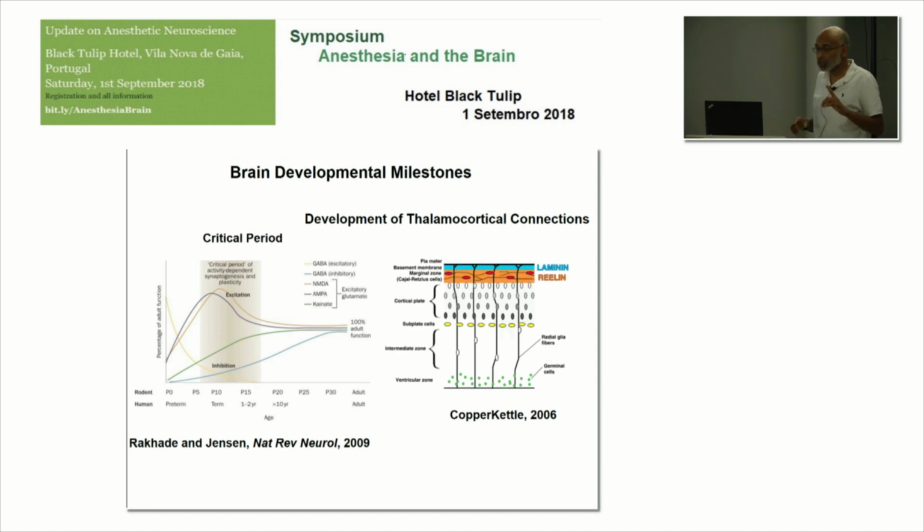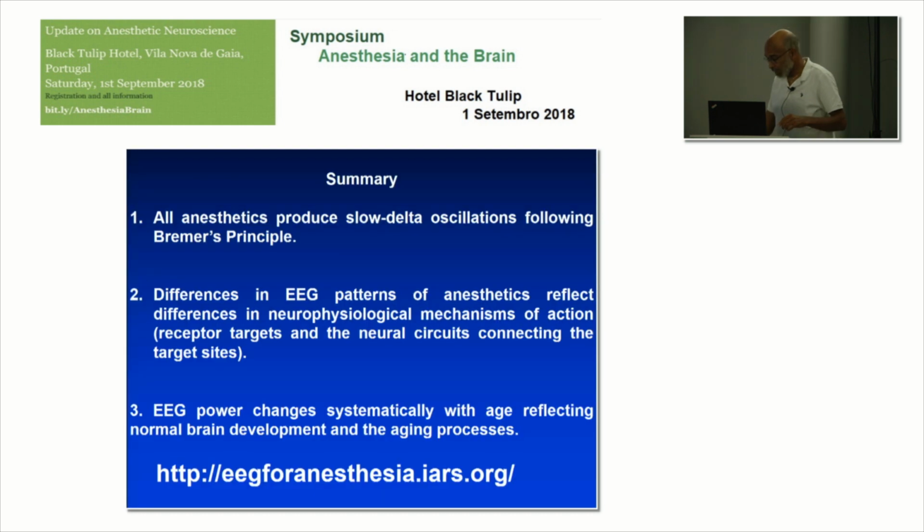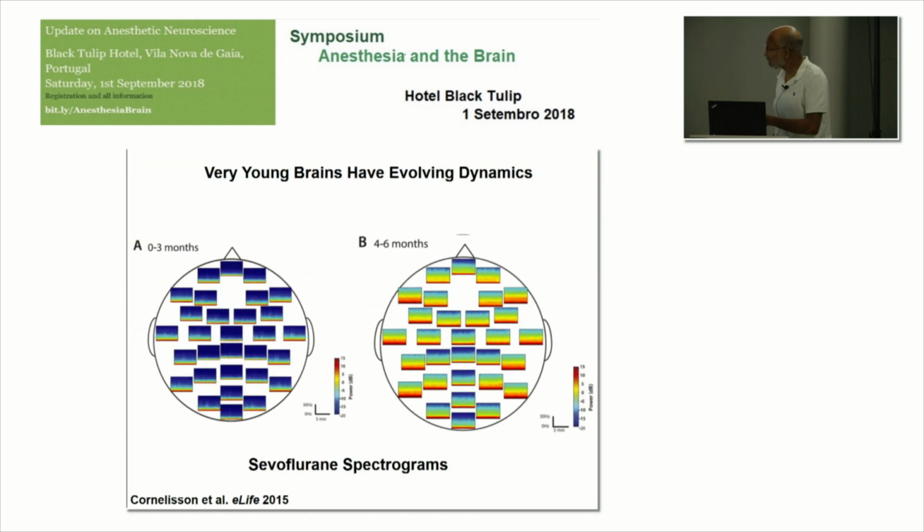And so one of the things that we postulated was that that process hadn't taken effect sufficiently back here at 3 months of age. We discussed this with Carla Schatz, who's one of the world's experts on brain development, and she said this makes perfect sense. One of the most interesting things about it is that she had no biomarkers of this. The earliest biomarkers that she was aware of is about a year of age, essentially. And this is something you can see under anesthesia when kids are between 3 to 4 months of age.